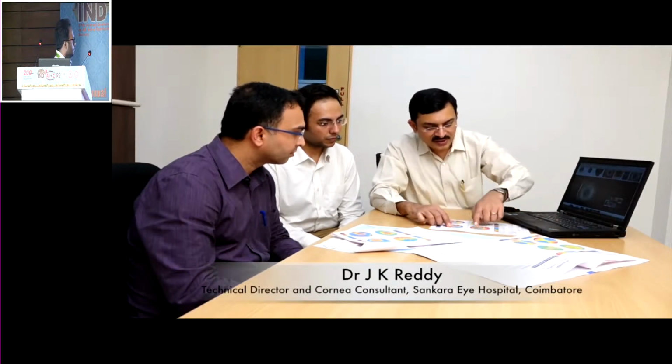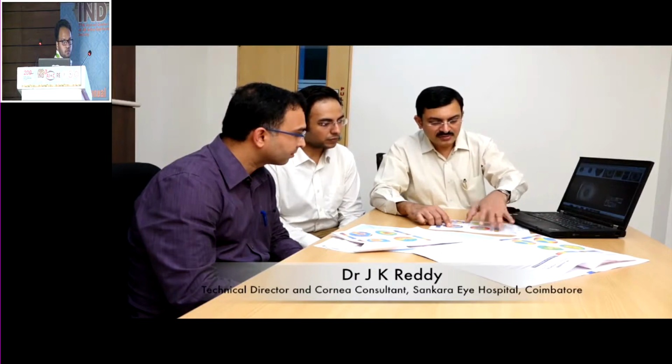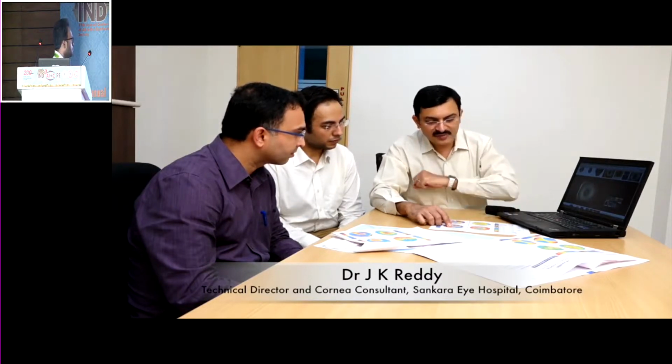Surgery, this patient is doing very well, but if you look here, there's a lot of astigmatism. Even after suture removal, we are not able to control more than 10 diopters, 15 diopters. So this is a bad result. And here, there's a lot of coma. All eyes, the cornea is shifted, so we cannot properly correct this. The main problem here is the intraoperative suture.